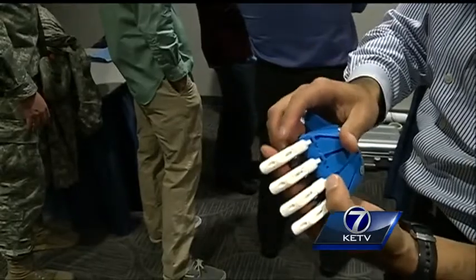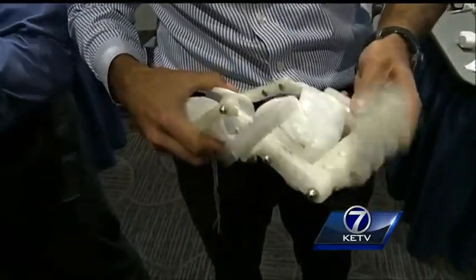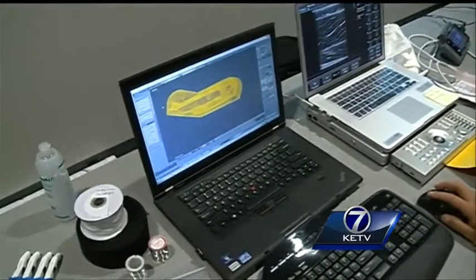The materials are aluminum — they're very light. Dr. Jorge Zuniga, assistant professor of exercise science at Creighton University, shows us that making a mechanical hand is actually simple, and says the software is out on the internet for anyone to use.